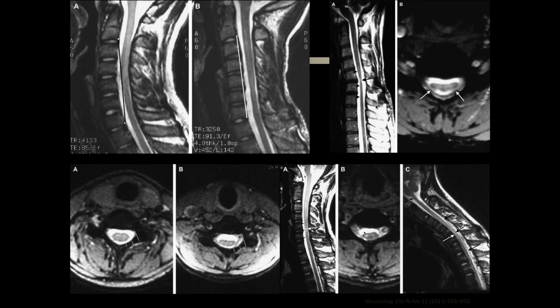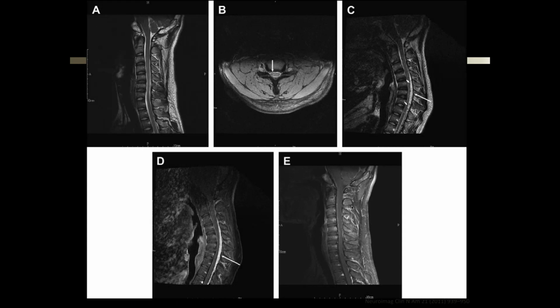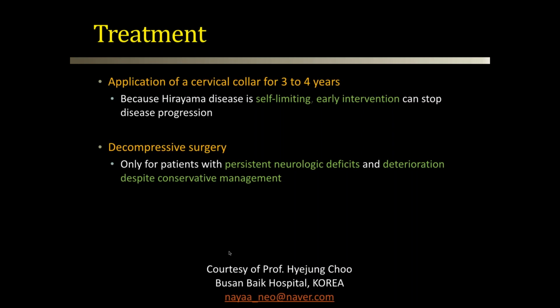Okay, here are just some other examples showing the atrophy right where the cord should be widest, with increased space in the venous plexus. And that looks normal when you go back to the normal position. So if you're concerned about it, people believe that you should reposition the neck in flexion and rescan in the sagittal plane to see this. I don't know if they've actually done studies to see how frequently you can see dilation of the venous plexus dorsally in normals. It would be interesting to see. But I haven't really reviewed the literature in depth on this particular disease, since I just haven't seen very much.